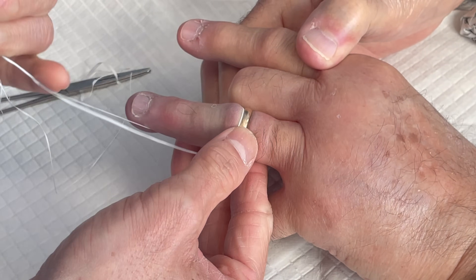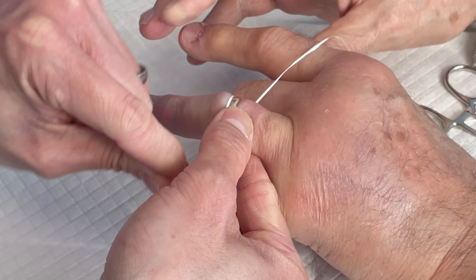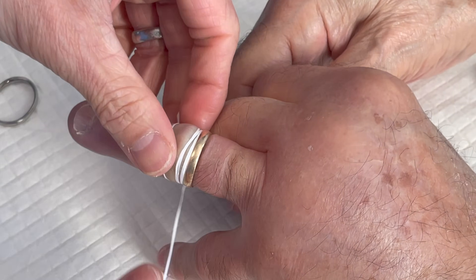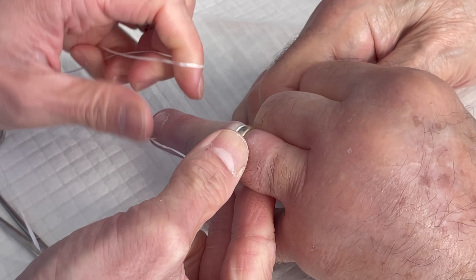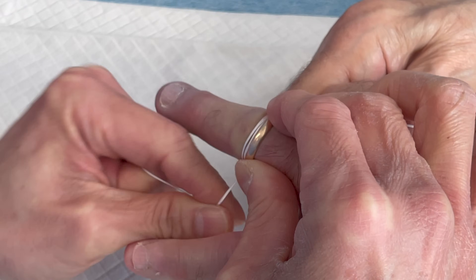An additional thing you can do for the patient — and we actually did this for this patient — is inject a little bit of lidocaine into a digital nerve block. That's why you'll see a sudden change in the background in this part of the video, because we injected him. He felt he was not tolerating it well enough, and the nerve block helped him tolerate the rest of the wrapping of the finger.